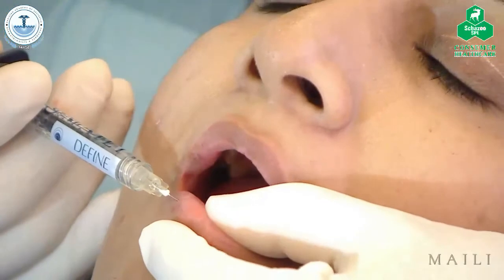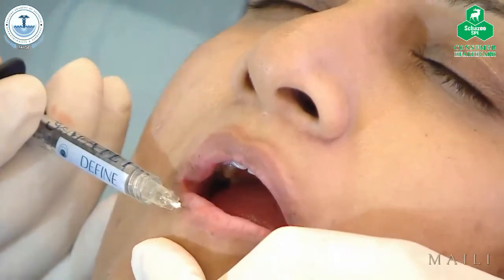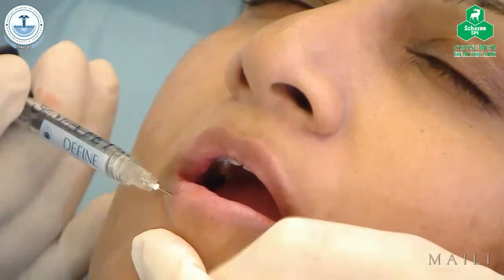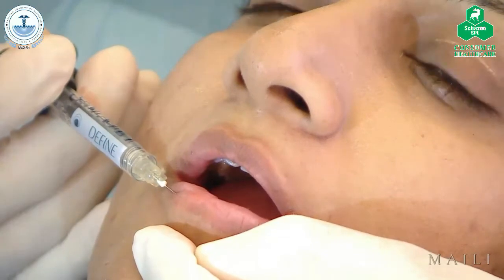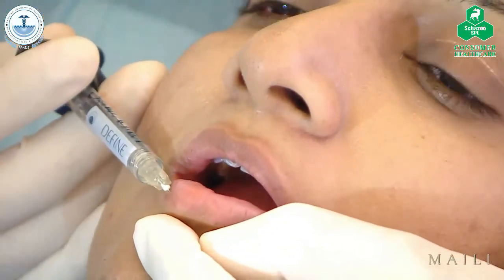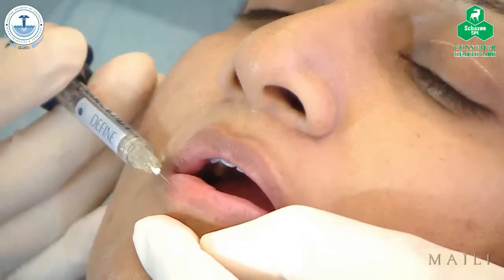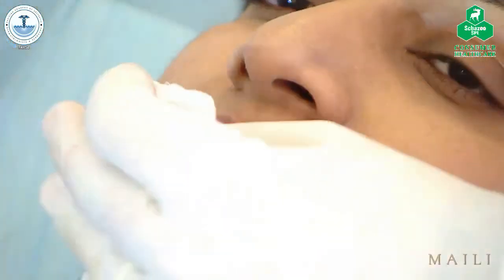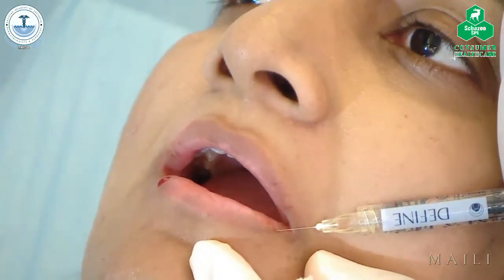One at the junction of the dry mucosa with the wet mucosa. The other one in the middle of the dry mucosa. The third one closer to the skin-mucosa junction. And that's it. The same thing on the other side. I'll try not to be in front of you.